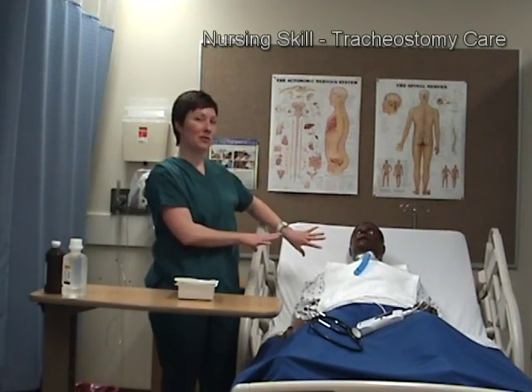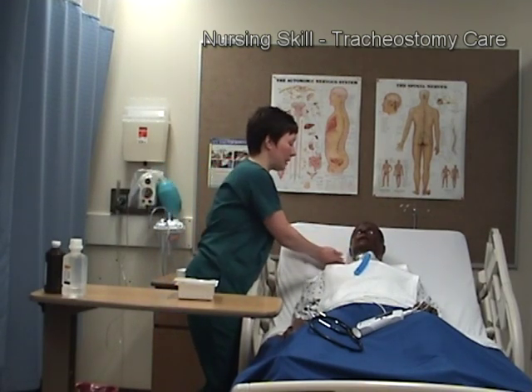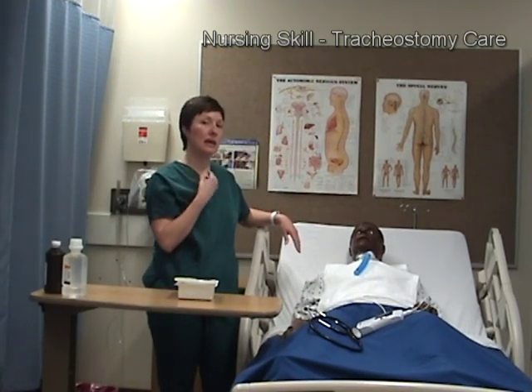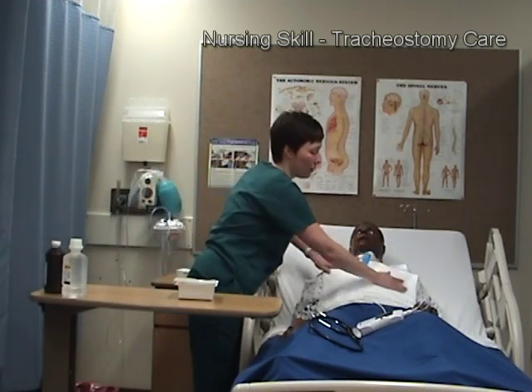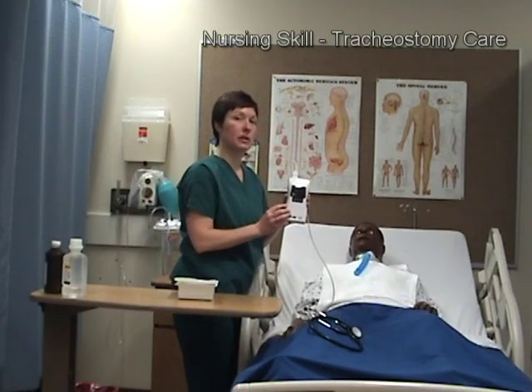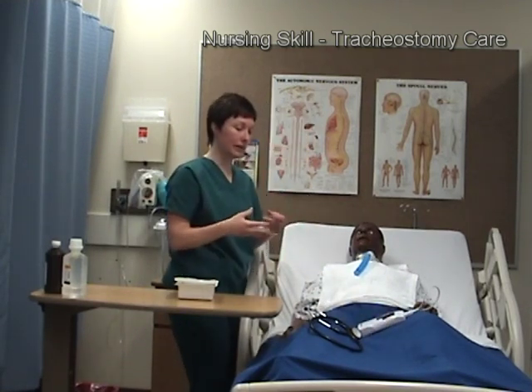I've already prepped my patient for purposes of the video. I've removed the pillow from the back of the patient's head and placed a rolled-up towel. That's going to open up the trach for me and make it easier to perform my treatment. I've draped a towel over the patient to keep them as clean as possible, and I've connected a pulse oximeter to continuously monitor their oxygen saturation during the treatment.